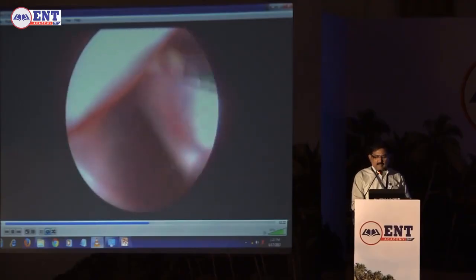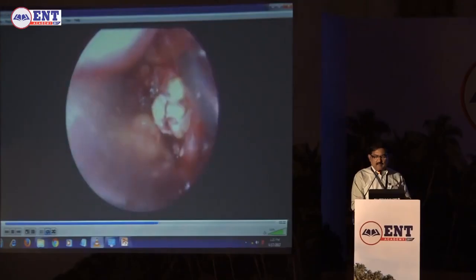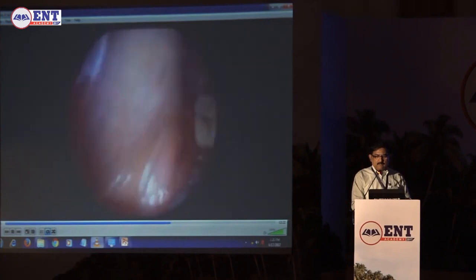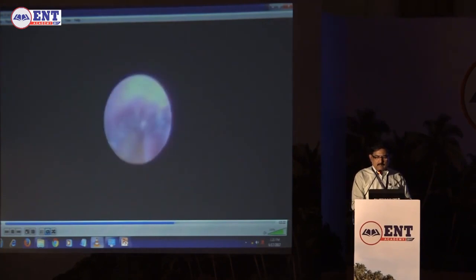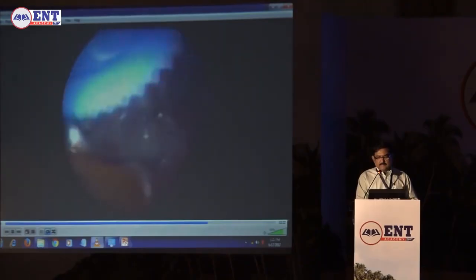This is another case. Like this, several cases have been done, all megastones. These were the initial days when even megastones I tried to drill my way through. It doesn't work. Neither can you basket it. The best is to go for double approach. This is a double approach.